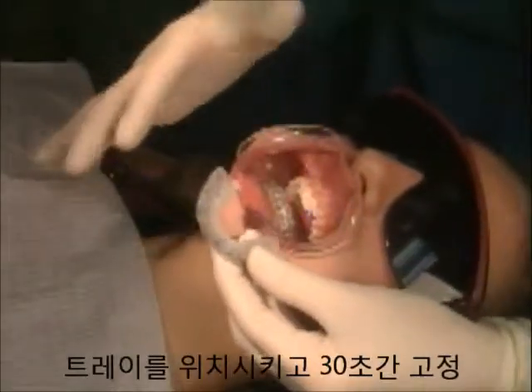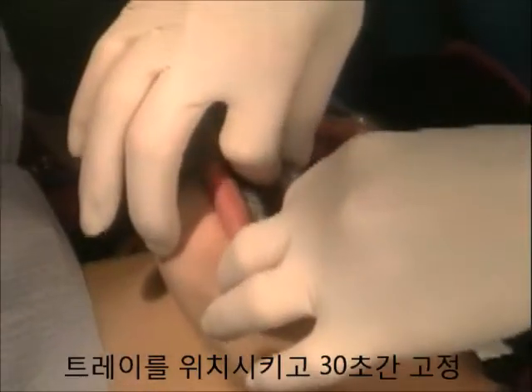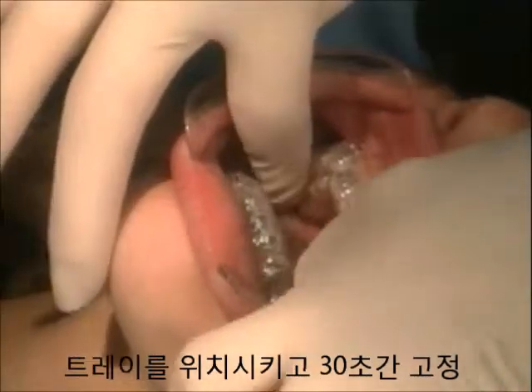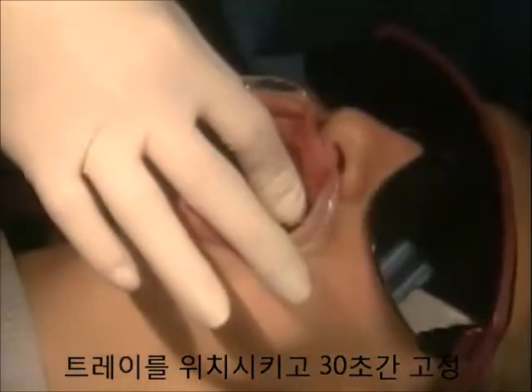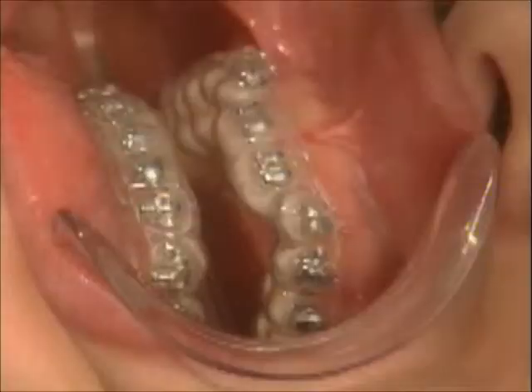Note the firm pressure occlusally, labially, and buccally to avoid tray rotation. Hold the tray firmly for a minimum of 30 seconds using a timer. After the 30 second hold time, let the tray sit for 2 minutes.